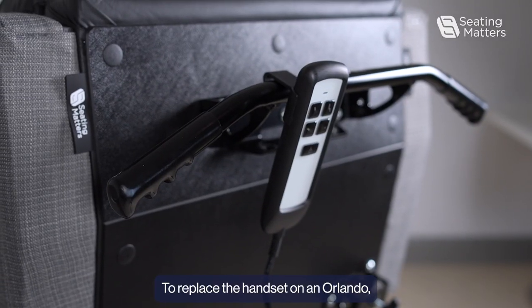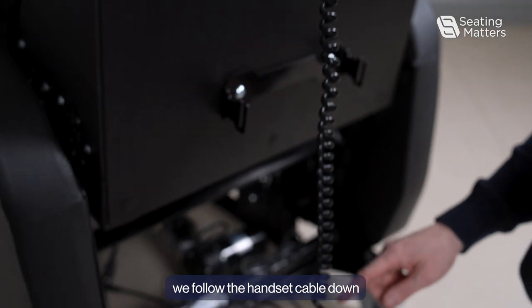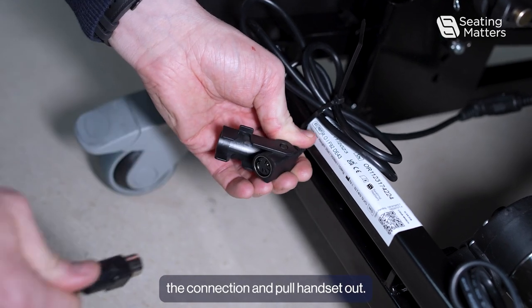To replace the handset on an Orlando, follow the handset cable down to where it fits into its connection, then simply release the connection and pull the handset out.